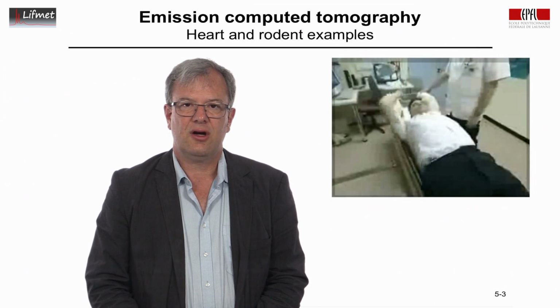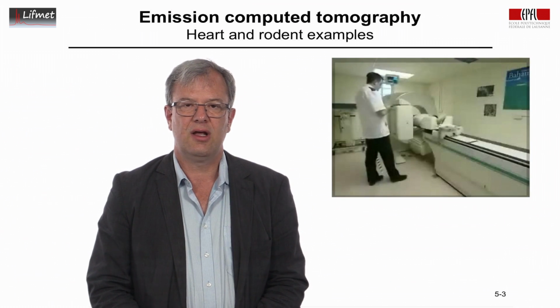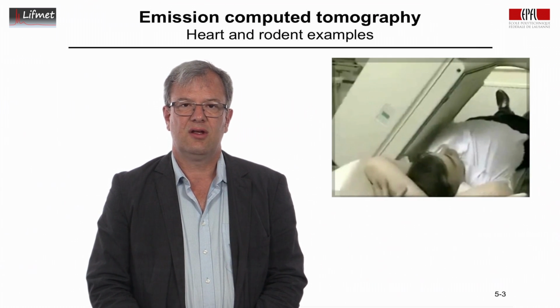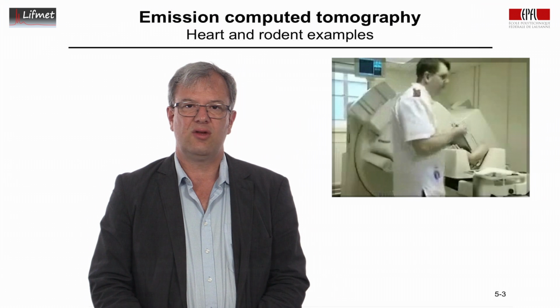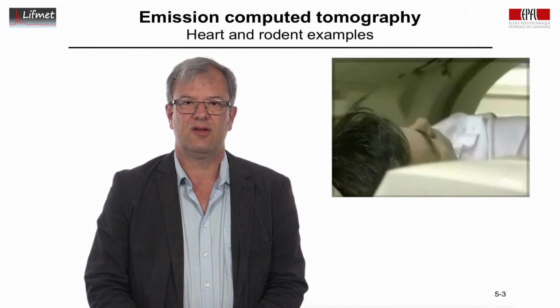Then one waits a certain amount of time. He's being put onto the scanner. Here you can see the patient bed, and as he is on the scanner, you will see that there's a big box that starts to move. That is actually the instrument that is now being moved physically around the subject.